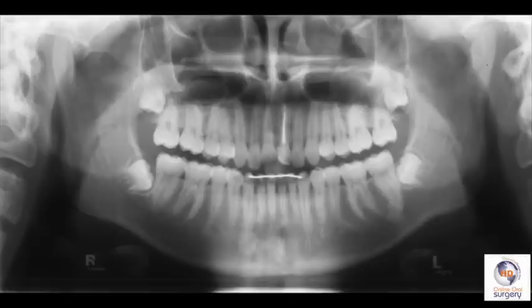These teeth have been completely asymptomatic, but as you can see from the radiograph, there's absolutely no way that these are going to come in to be in function and able to be maintained by the patient. We know at some point they are going to become problematic, and it's much better to do it while the patient is young and healthy and before the roots fully develop, rather than waiting until the patient gets older when the surgery will be more complicated and recovery more difficult. Since his impactions are fairly symmetrical and we can get a much better camera angle from the right side, we're going to show removal of tooth number one and 32 only.